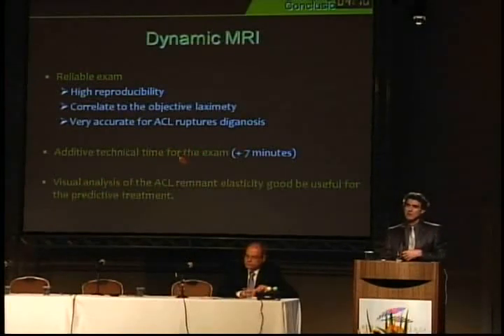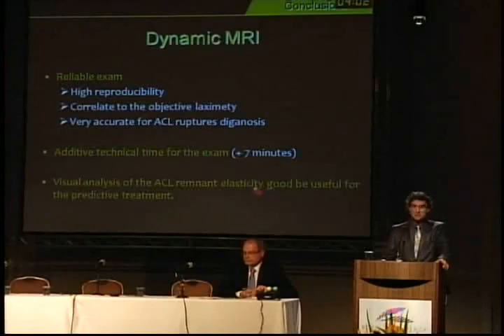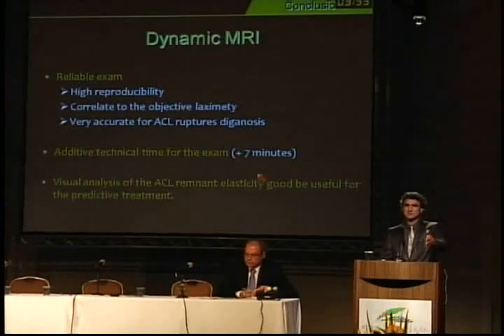It's not a long exam, because it adds 7 minutes to the normal exam, and maybe this could allow us to tell the patient the prognosis of his partial ACL tear, and also to schedule a partial augmentation or a normal ACL plasty.